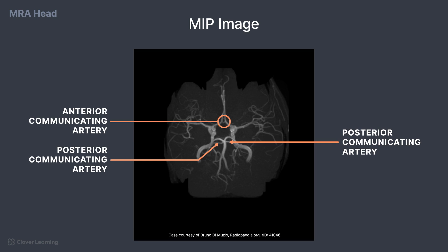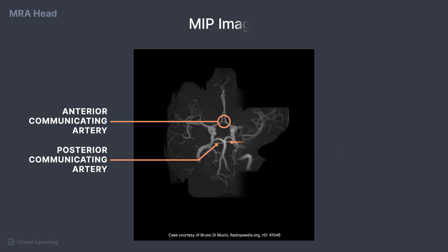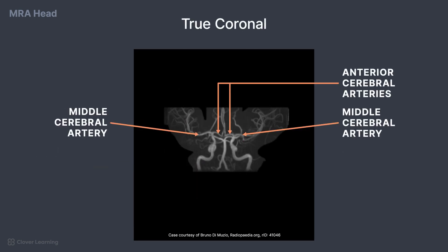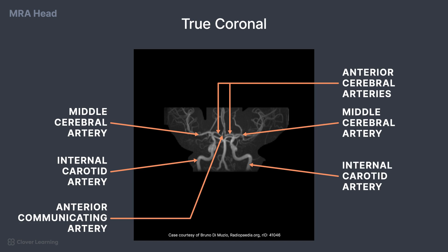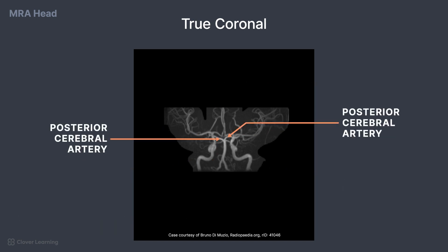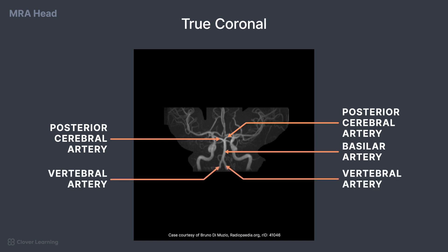Now that we have seen the images in an oblique orientation, let's look at the structures in a true coronal, sagittal, and axial orientation. Here we can see the anterior cerebral arteries, middle cerebral arteries, and internal carotid arteries. For the posterior circulation, the posterior cerebral arteries, basilar artery, and vertebral arteries are visible.